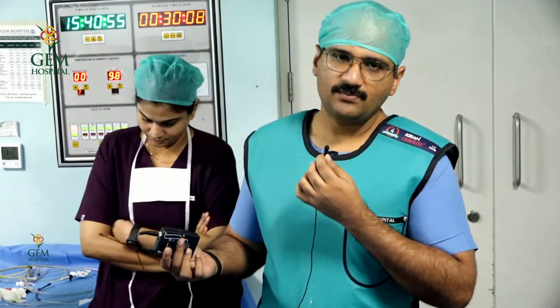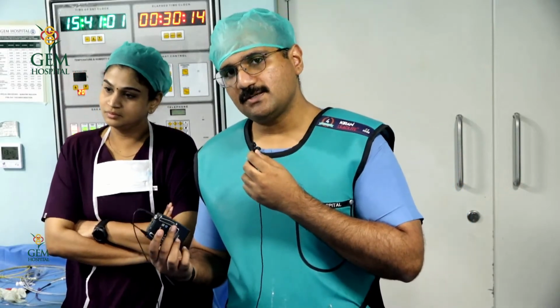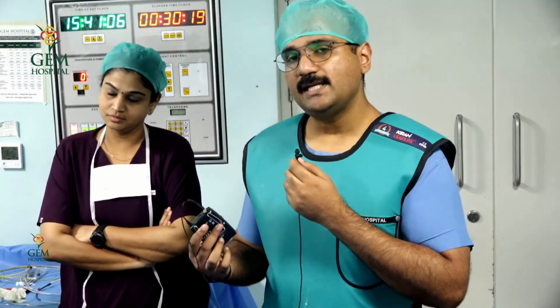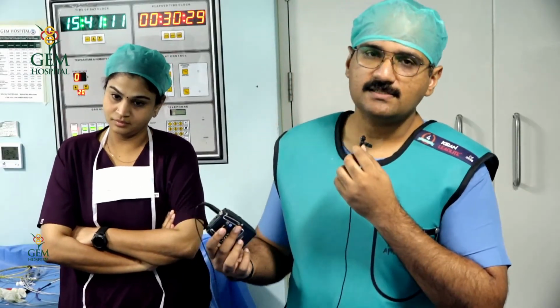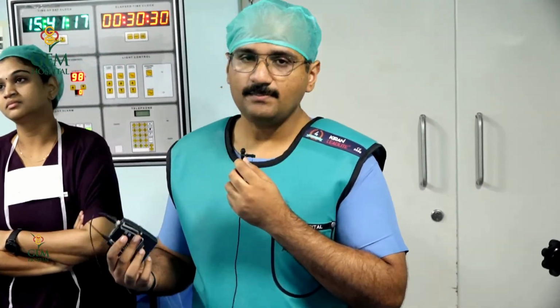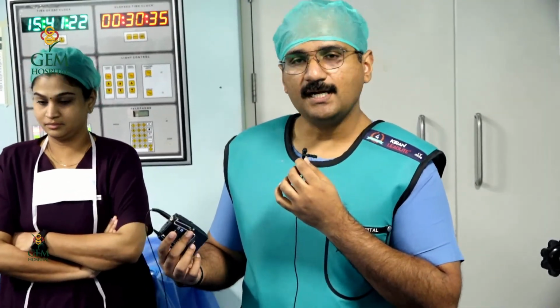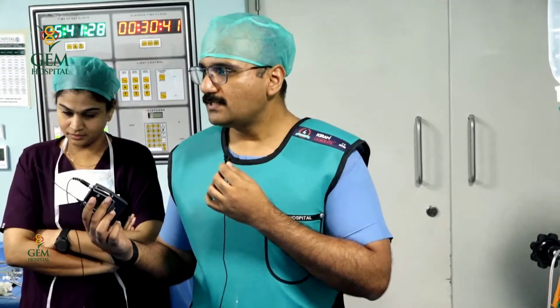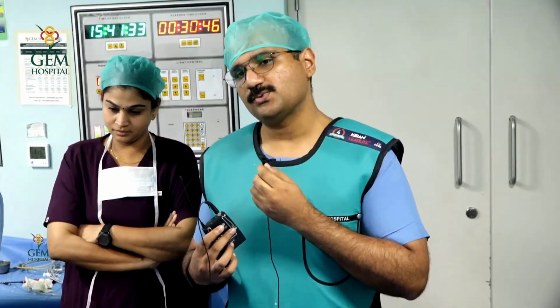This is the immediate follow-up. After stent removal, we'll still be watchful of the biliary stricture, whether it is evolving further, whether it is causing an LFT change in future. In that case, we need to really dig into other causes of biliary stricture also, most importantly, in males, an IgG4 related pancreatobiliopathy, which is a very important differential diagnosis we should not miss. We cannot blame just the small diverticulum which we have, because what we see is a dilated CBD with a smooth tapering distal CBD. So this is a case which we will have to follow up in future.